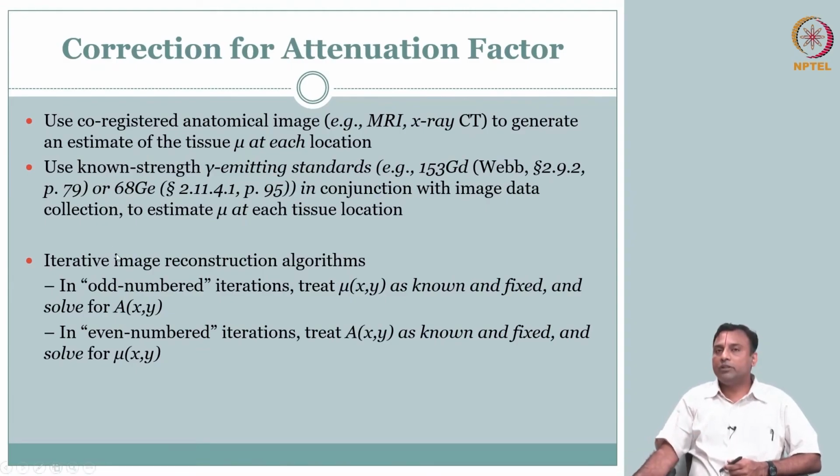Another approach is iterative image reconstruction, which is currently gaining much popularity because of all these computational advances. So we will make an initial guess. In one iteration, I will treat mu of x comma y as known.